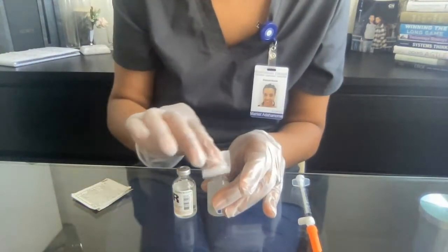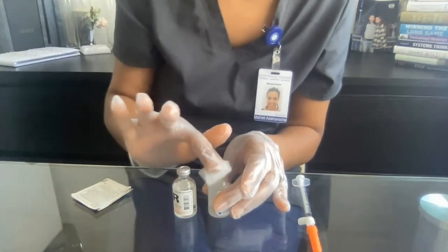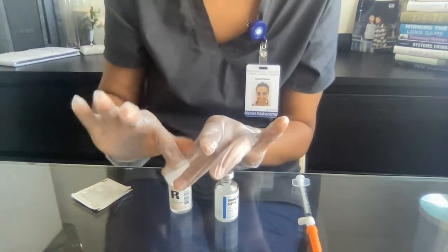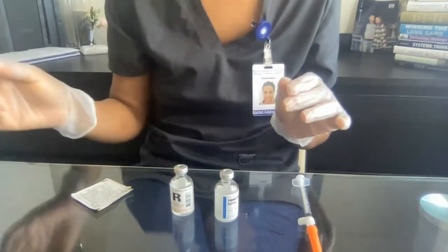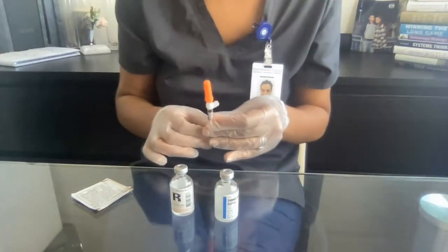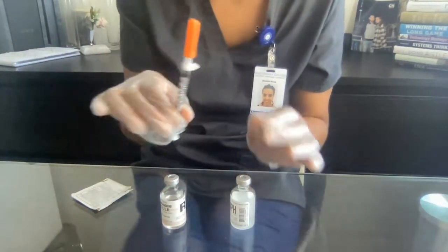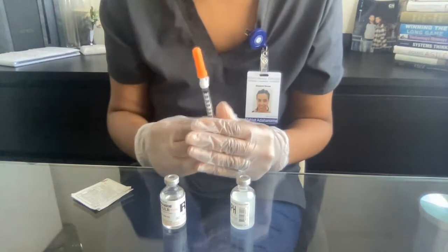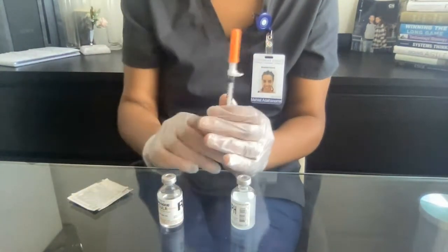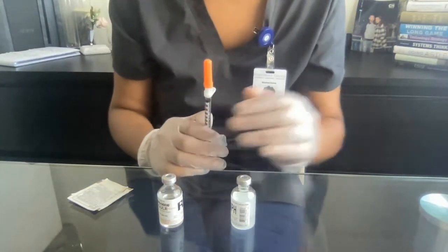Then I'm going to get my alcohol swab and wipe off the tops of both insulin vials for a good 5 seconds. Trash that. Now with the needle cap still on, I'm going to draw air with the syringe. The orders I was given are 4 units regular and 8 units NPH, and the total is going to be 12 units of insulin that I will be administering to my patient.